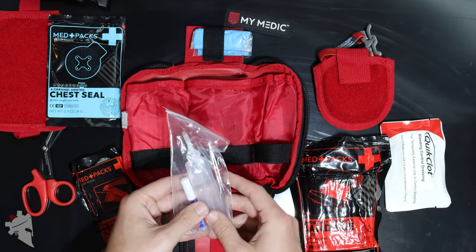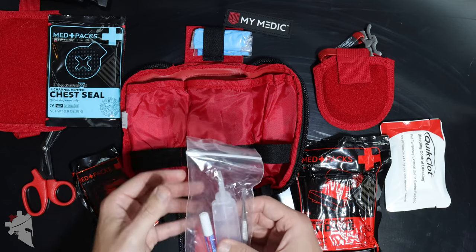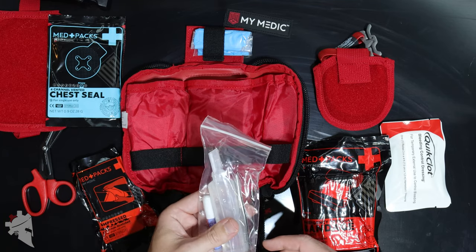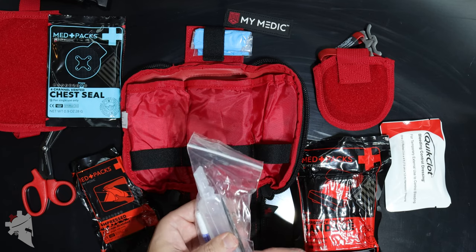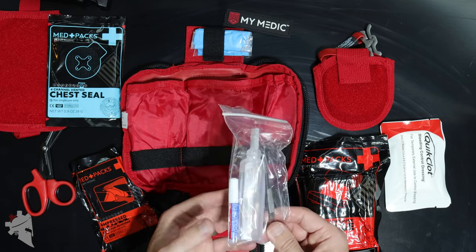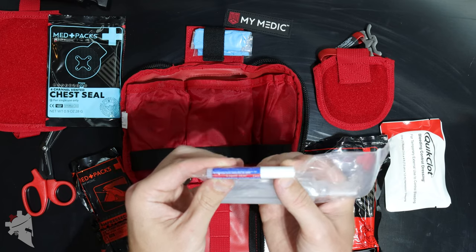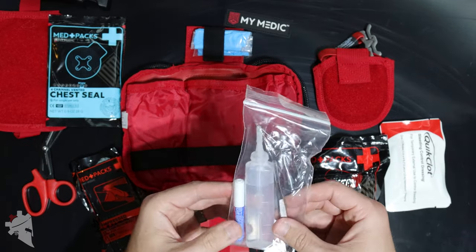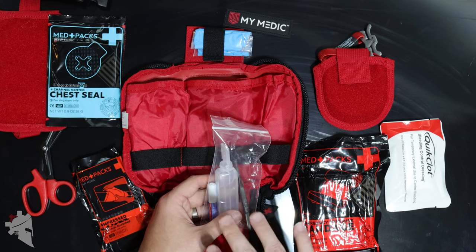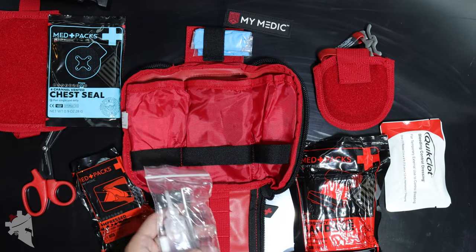We didn't have a Mimetic bag on the range that day, but we did have a full medical kit and were able to handle the situation. Being a smaller individual kit, it's really nice to see tweezers included because shrapnel in your body is difficult to pull out if it digs in. You can also use the tweezers for ticks and splinters. There's also saline solution and this small tube of liquid skin — essentially a liquid band-aid that dries over a wound and creates a protective barrier.